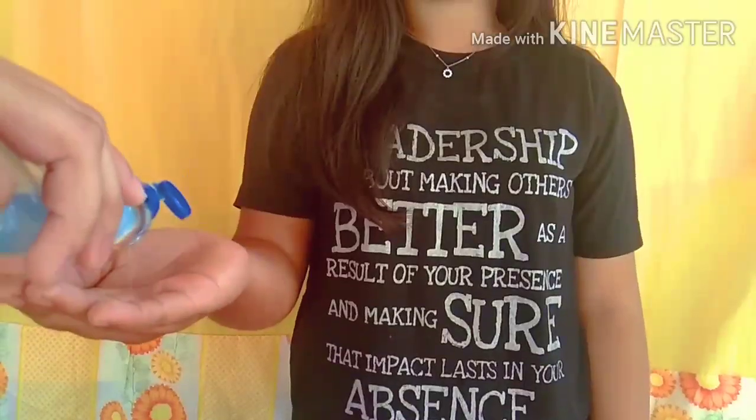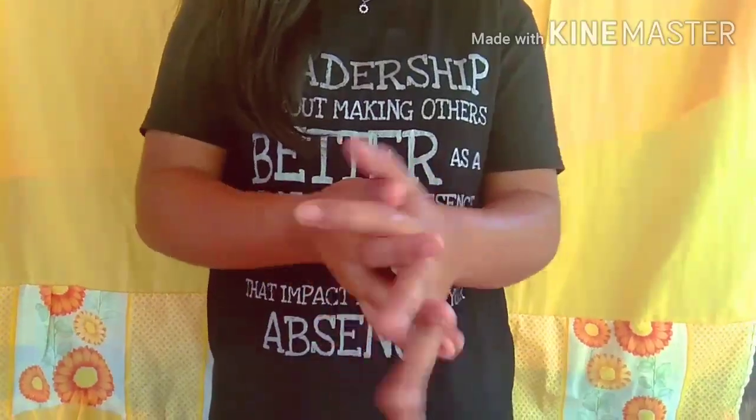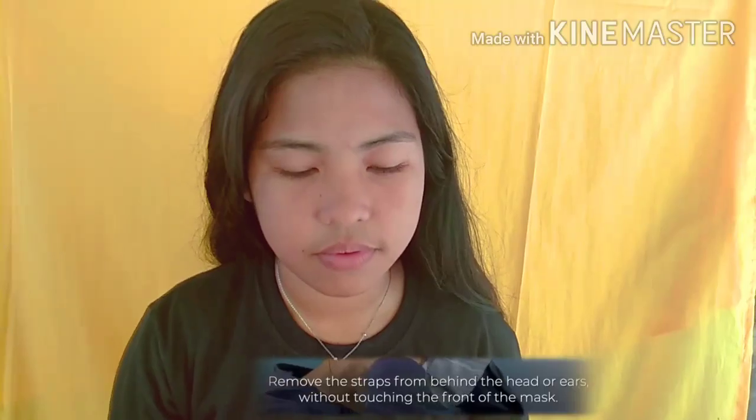How do you take off a medical mask? Before touching the mask, once again, ensure that you clean your hands with alcohol-based hand rub. Remove the straps from behind the head or ears without touching the front of the mask.